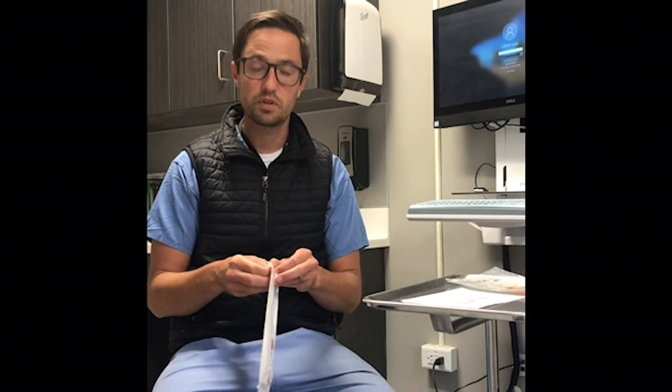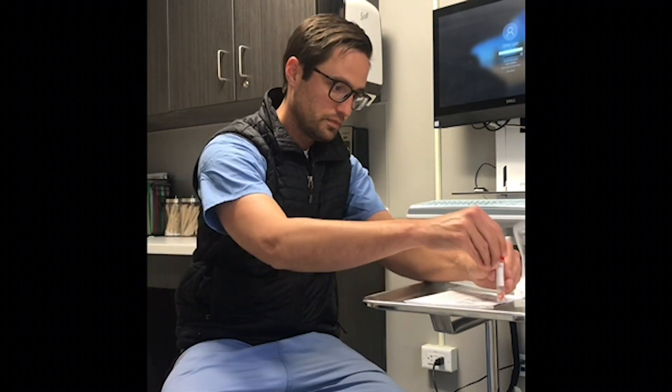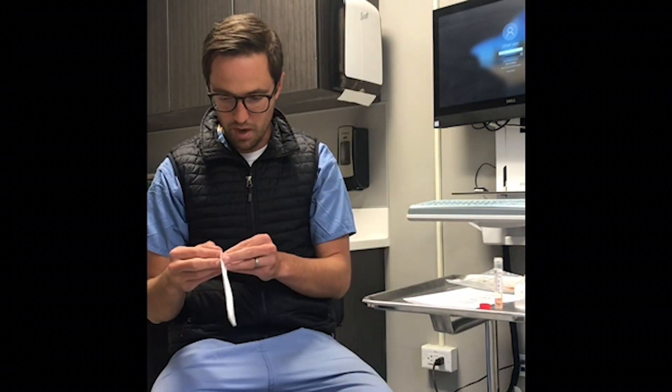Gently open the swab kit and you'll find the swab and the collection tube. Go ahead and gently open the collection tube, have it ready, and then gently open your swab.